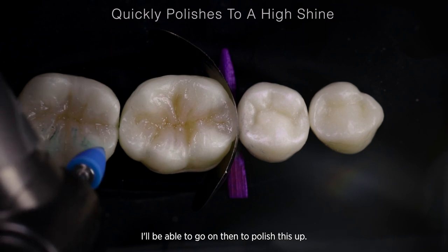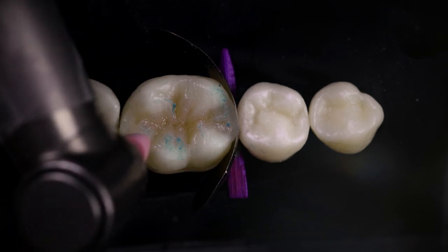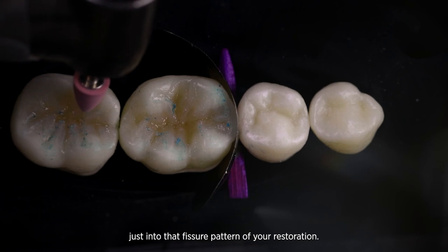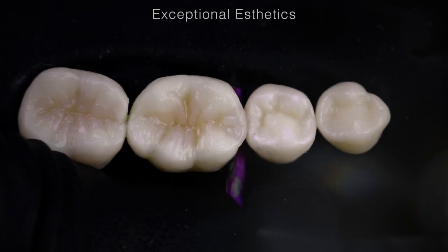I'm just going to use a series of flexi points here, and a little bit of enamelized polishing paste. One nice touch you can do is add a little bit of stain just into that fissure pattern of your restoration — it'll give it a natural warmth into the center.